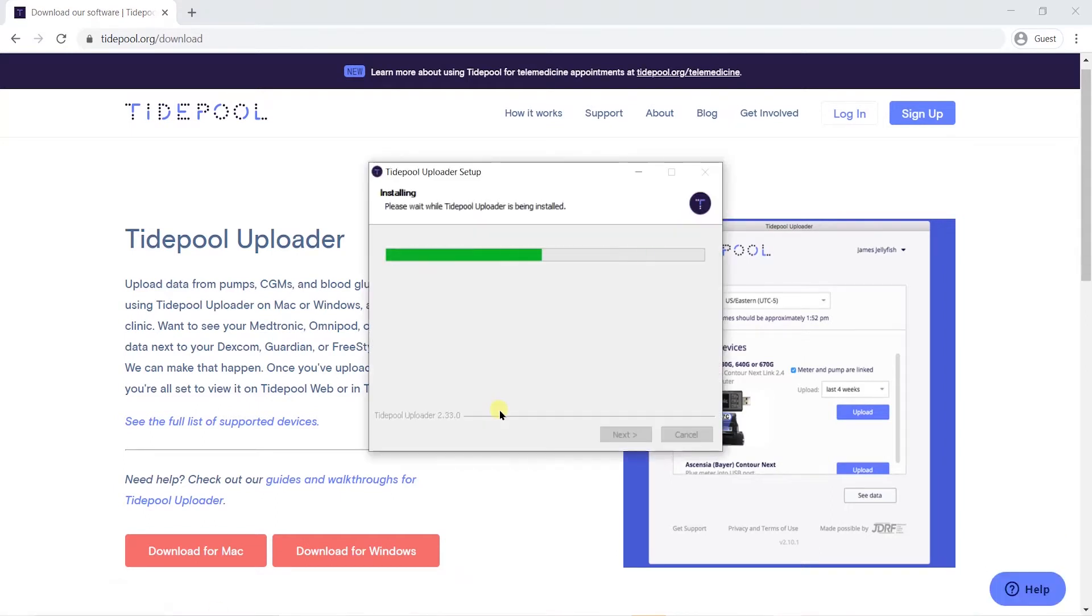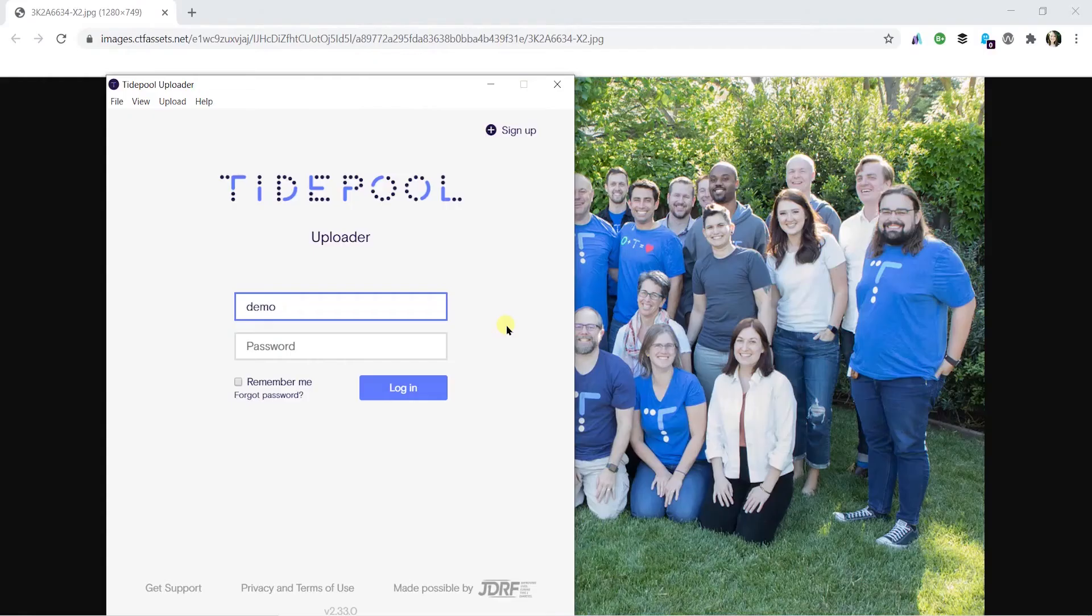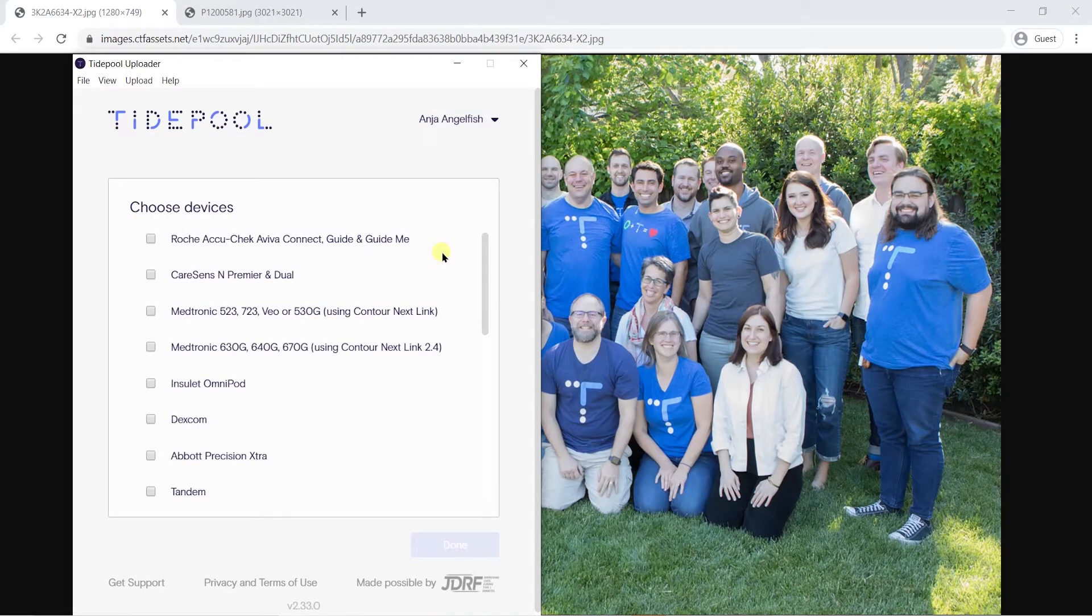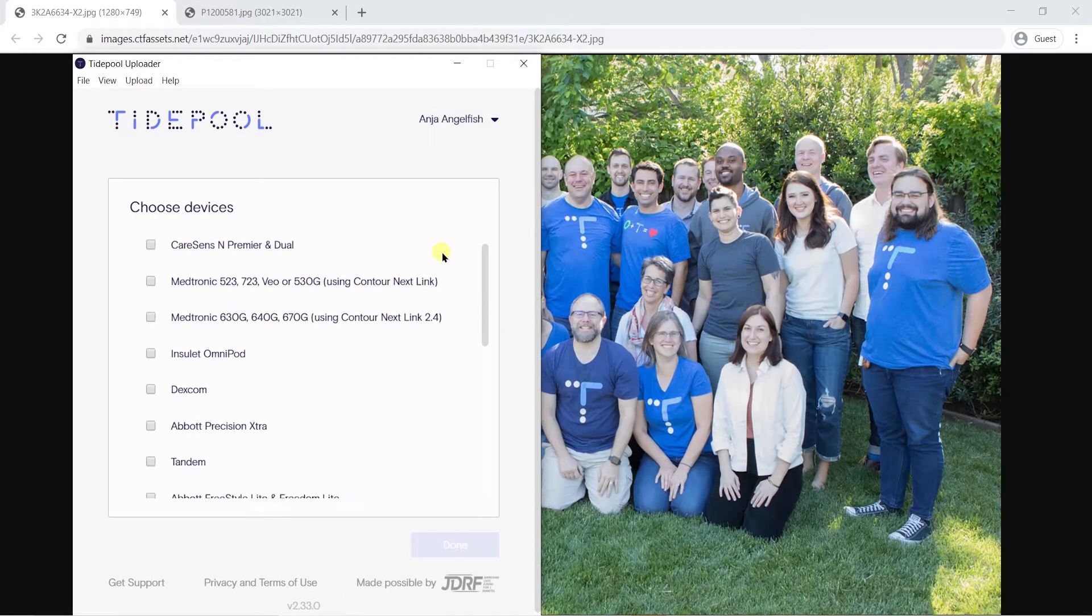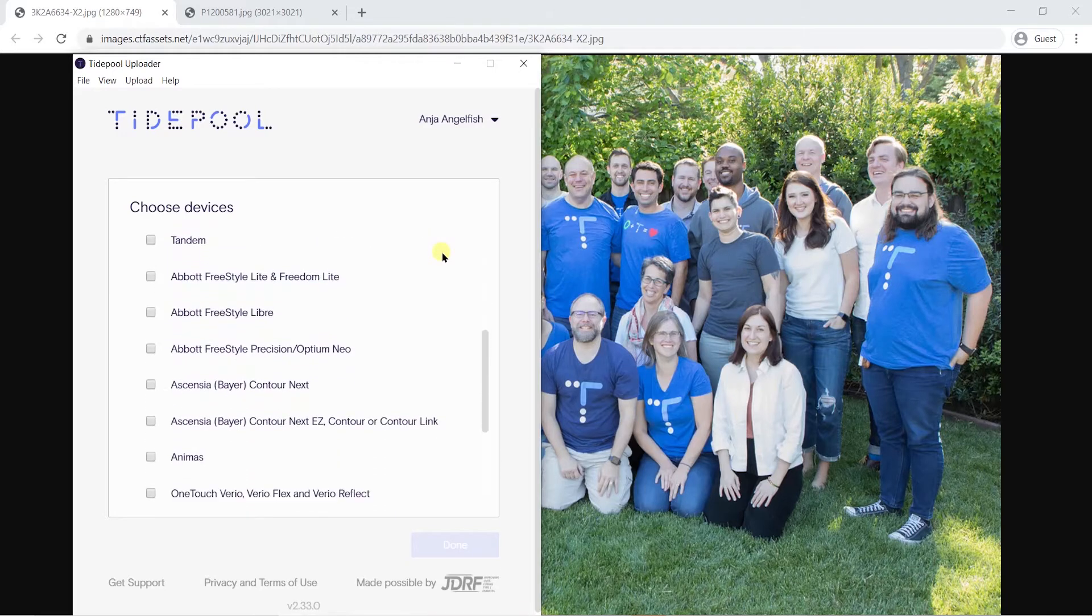Once you have Tidepool Uploader installed, open the app and log in to your account. The first thing you'll see is our Choose Devices menu, where you can select any devices you're currently using.